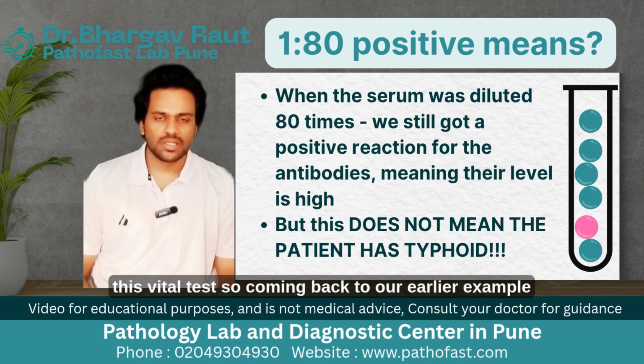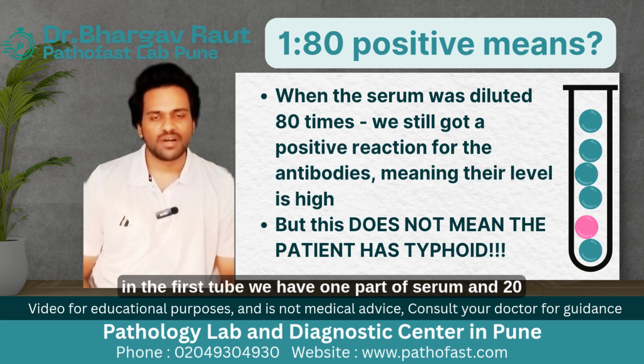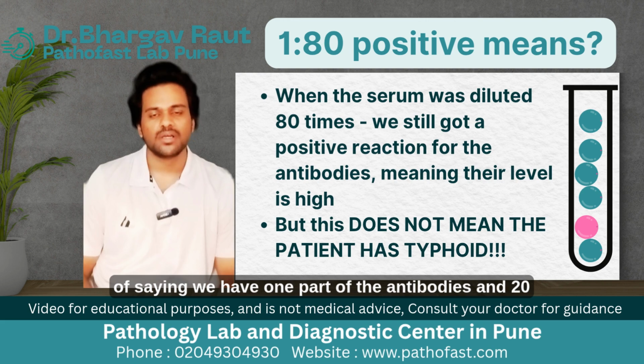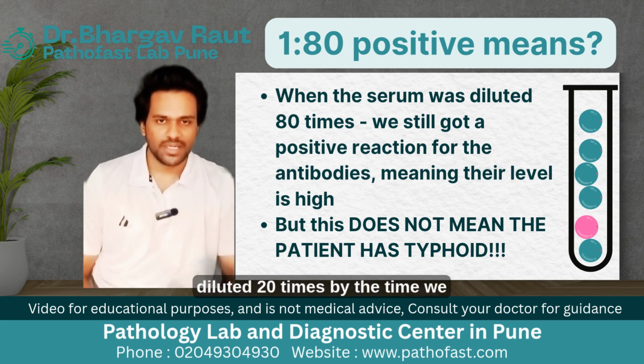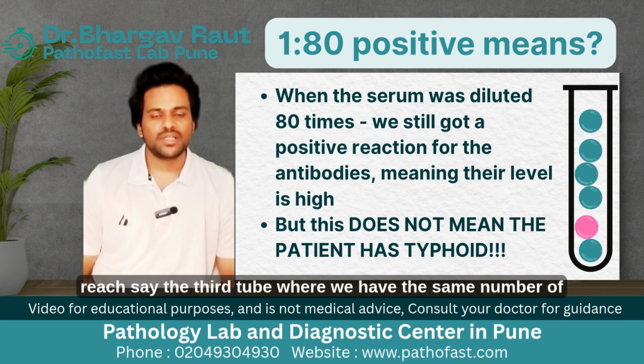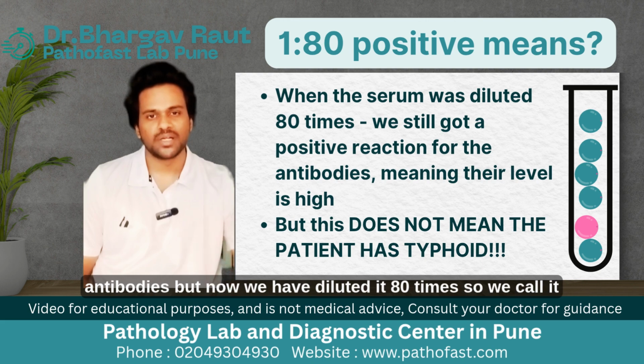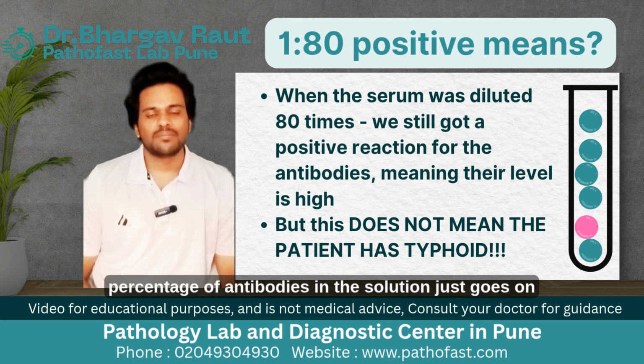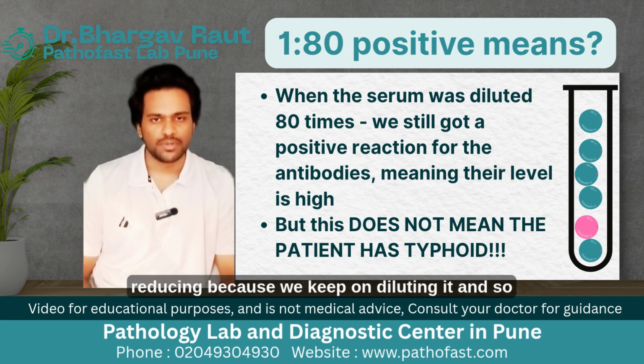So coming back to our earlier example, in the first tube we have 1 part of serum and 20 parts of the diluent. That basically could be one way of saying we have 1 part of the antibodies and 20 parts, diluted 20 times. By the time we reach, say, the 3rd tube, where we have the same number of antibodies, but now we have diluted it 80 times, so we call it 1:80, we expect that the percentage of antibodies in the solution just goes on reducing because we keep on diluting it.